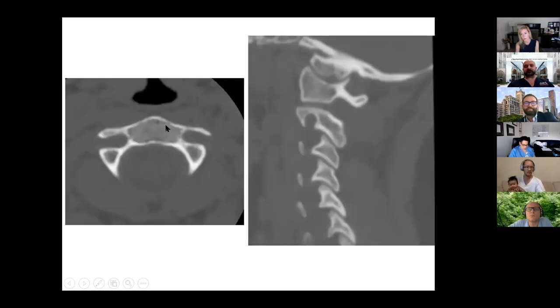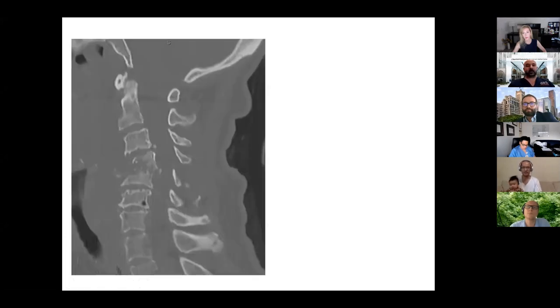Now, very quickly, the reason I look at C2 very carefully is because of this. This is a high-riding vertebral artery. So this is a patient that I can't safely put in a pedicle screw. Maybe some can, I certainly can't. I usually don't use navigation for this, but this is perhaps somebody you want to use either a translaminar or a pars screw. But if you don't look at this closely pre-op, you're like, sure, give me a 32 millimeter screw and you're aiming for the pedicle, there may not be a pedicle there. So you want to be careful with that.